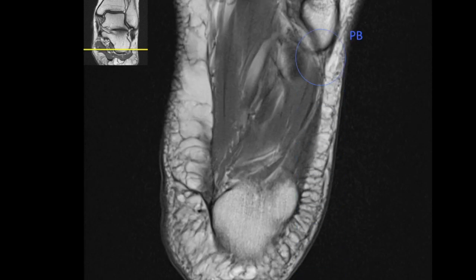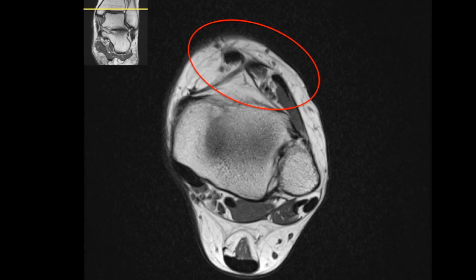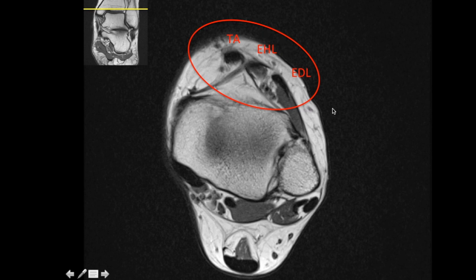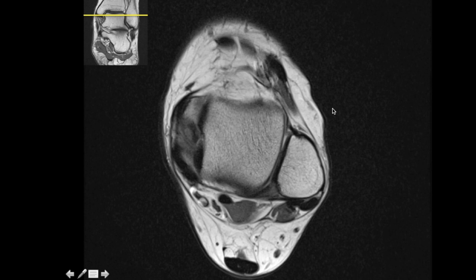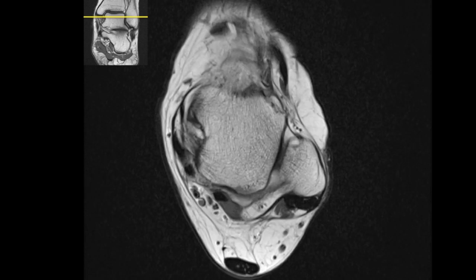Now we look at the anterior or extensor compartment, again going from superior to inferior. It also consists of three tendons, and the medial most tendon is the tibialis one — so this is the tibialis anterior. Anteriorly the relation is reversed compared to the medial compartment: it becomes tibialis anterior, extensor hallucis longus, and extensor digitorum longus. Remember, the extensor tendons are less involved compared to the medial flexors or the peroneal tendons.